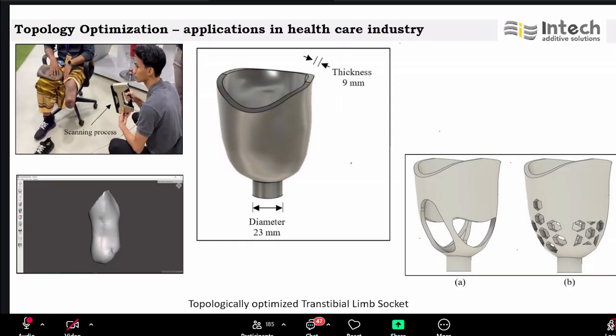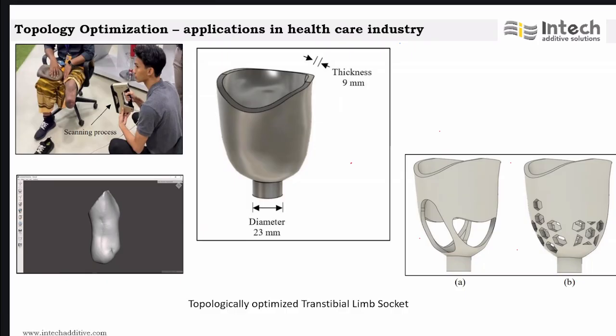The same person, Ram Krishna, is asking another question, sir. How would your mitigation strategy change if the same lattice were produced using electron beam melting instead of LPBF? See, we don't prefer electron beam printing, primarily. It's meant for titanium material. It could be fast, but mostly it's done in vacuum and so on, so the result we get is not so good, like the roughness and other things.